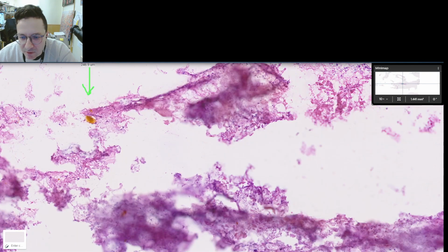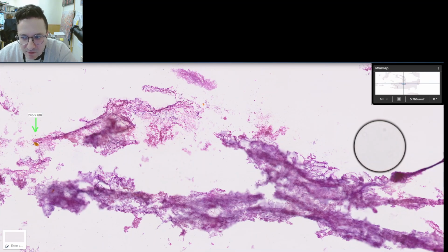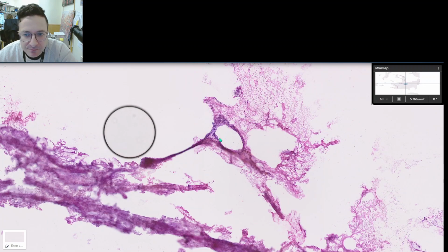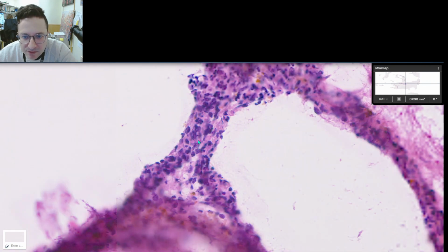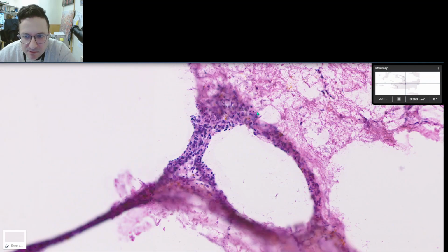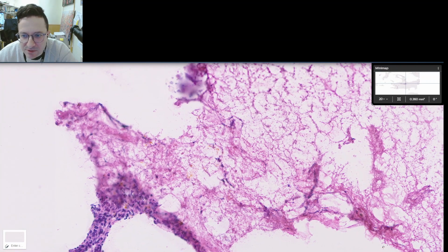And then this case was called descriptive, and then consistent with acute pancreatitis. And here's more of that acute inflammation, and you have maybe some ductular epithelium here, a ton of this yellow pigment hematoidin, and maybe some neutrophils, and a lot of this fat necrosis and saponification.